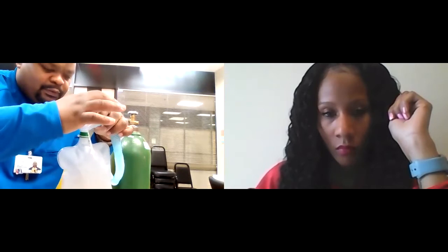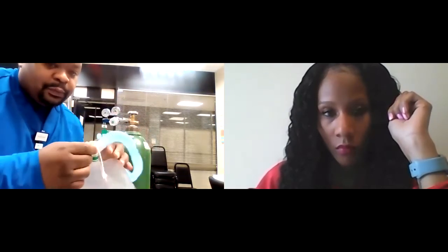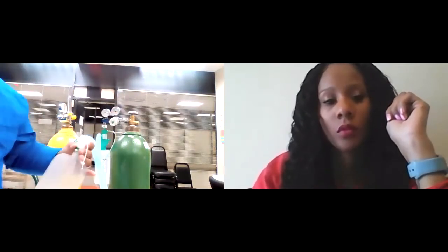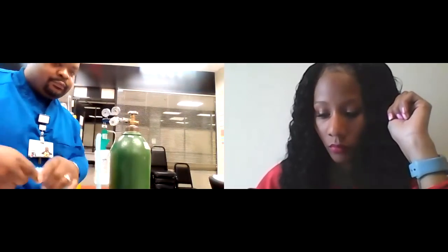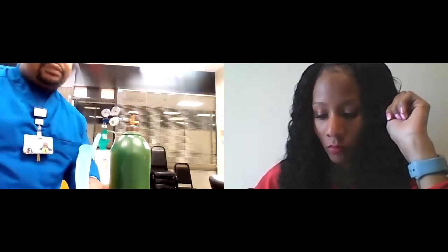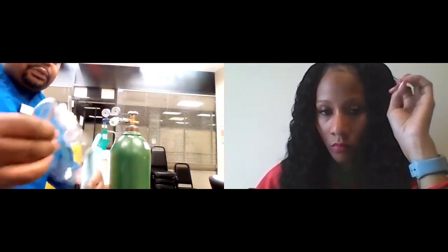Okay, after my water bag, so I can let it fill up a little bit with air or a reservoir. After my first water bag, now what do I put after here? Second large bore tubing, good. Second large bore tubing. And then finally, whatever I'm going to call it, it goes here, right? So we're going to do an aerosol face mask. So this is an aerosol face mask. So I'm gonna put this on, the aerosol mask. So now I have my aerosol face mask.